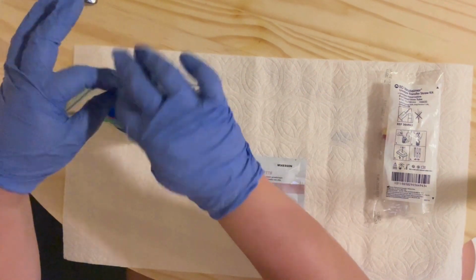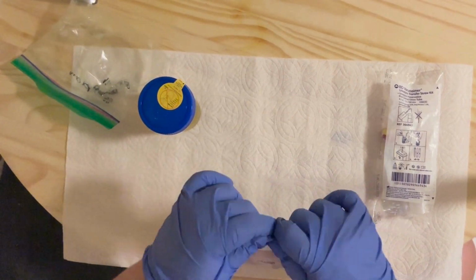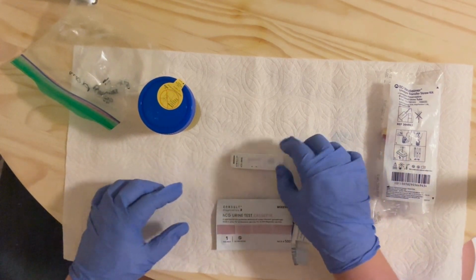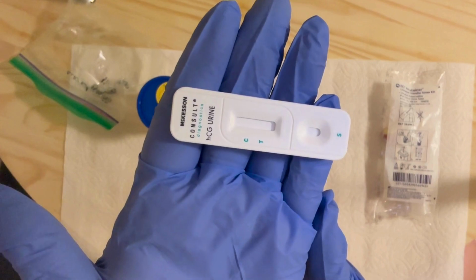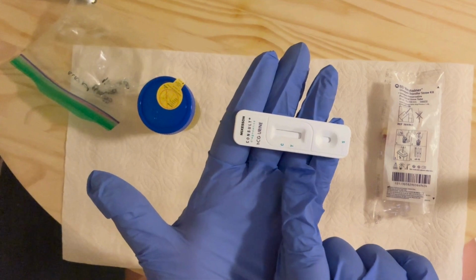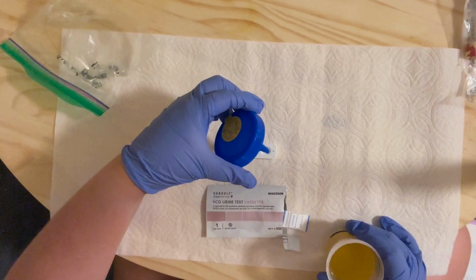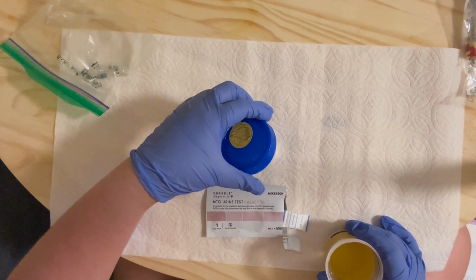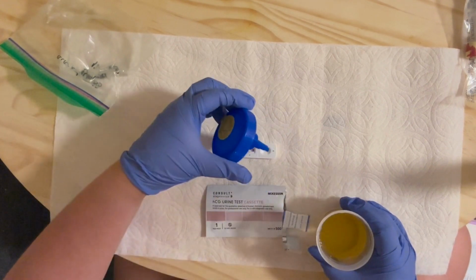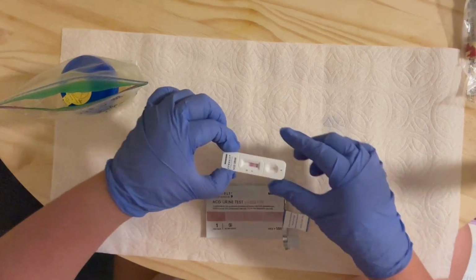If everything's up to date, I will go ahead and place it on a flat surface, and then open my specimen container, draw some quantity, and deliver 3 drops onto the specific site for the drops, which is 3 drops only. And then I would discard the collector, close the lid of my specimen container, and wait for 3 minutes to complete in order to read the results.